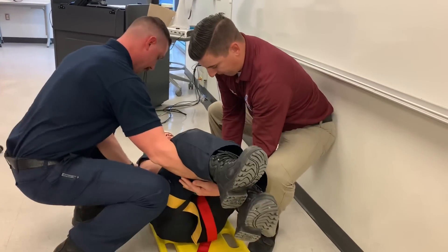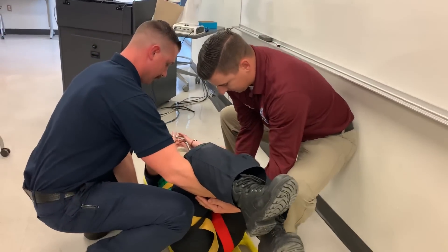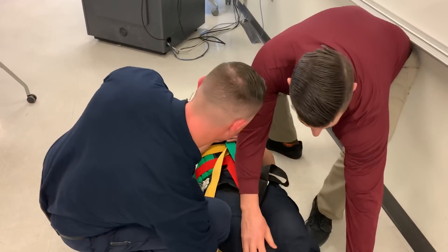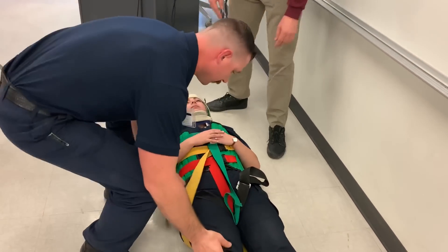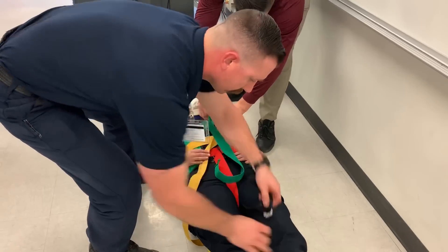Before you lower the legs, you want to undo the leg straps and gently lower the legs down onto the board. Then loosen the top strap.